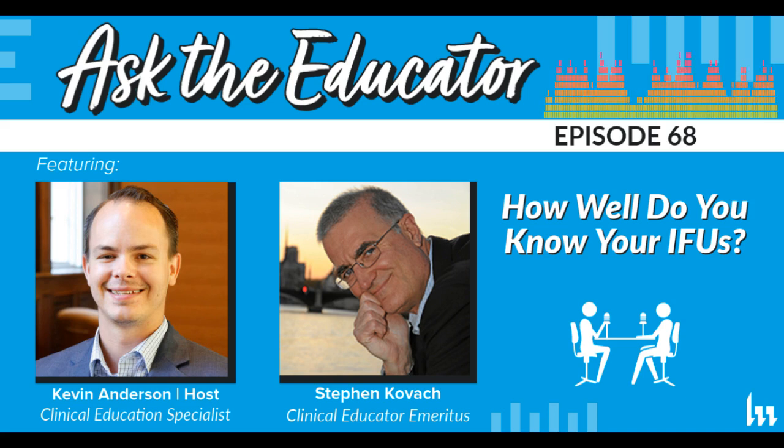Just because one shaver says to do it and another doesn't, how do you inspect? And so all shavers should be that way, because that is your standard of care. And if it can happen in one type of shaver, it can happen to another. That's right. And if people really read the warning that the FDA put out, it suggested that all shavers adjust their IFUs, but many companies didn't.